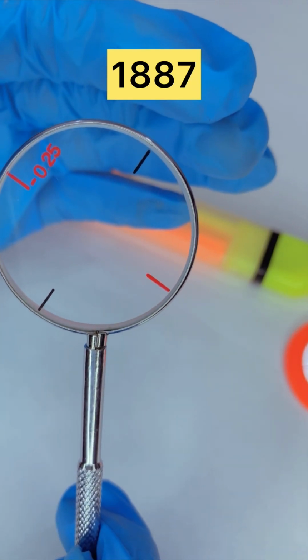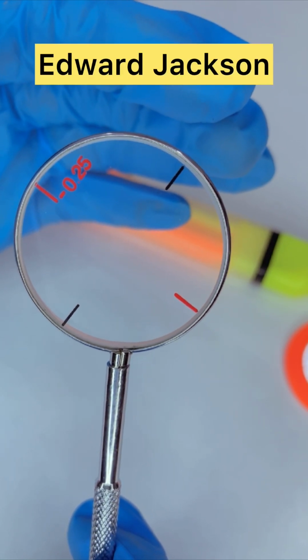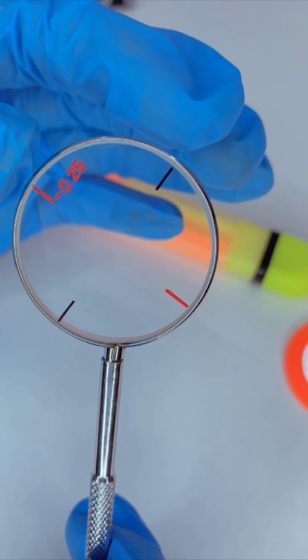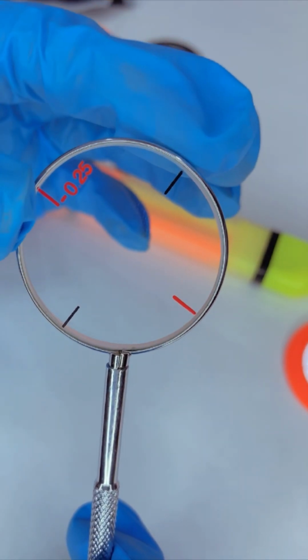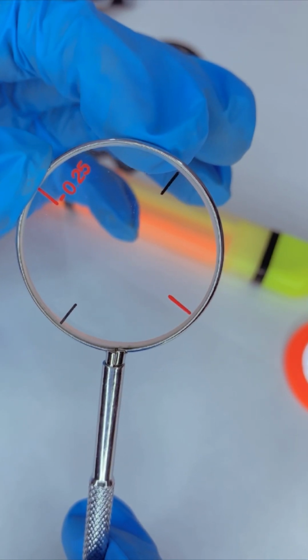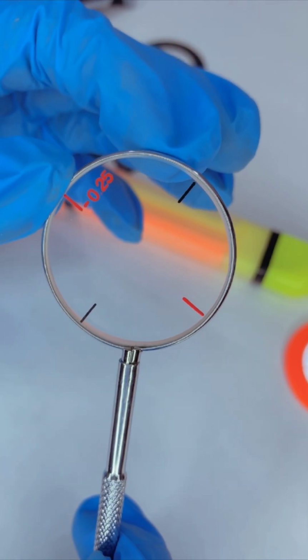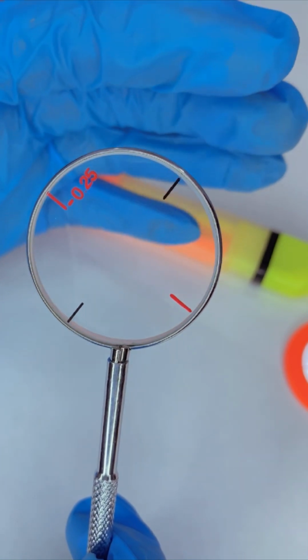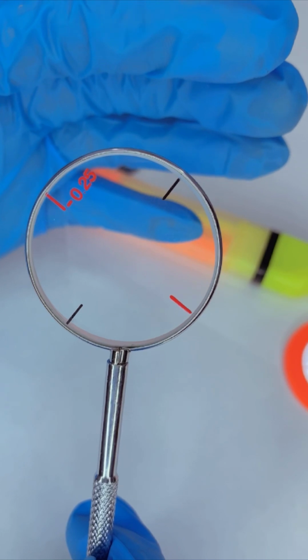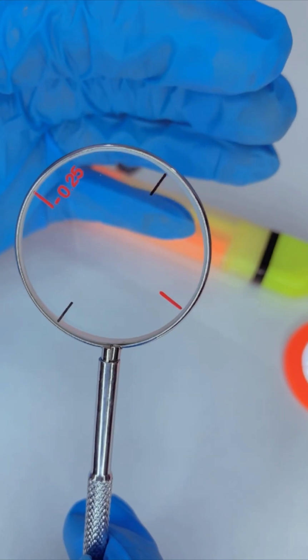In 1887, there was this man called Edward Jackson. In fact, he tried to describe a method of detecting astigmatism by using what I call modified Stokes lenses. So Mr. Edward Jackson tried to describe a method of detecting astigmatism using modified Stokes lenses in 1887.